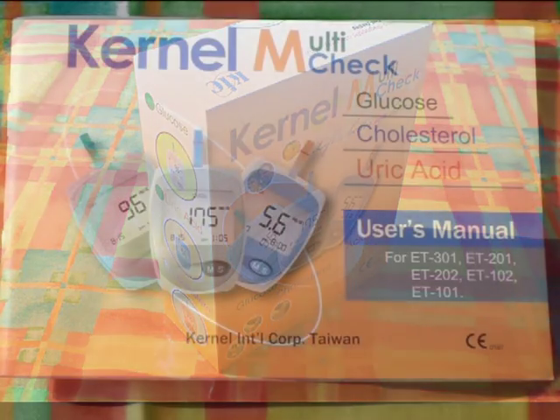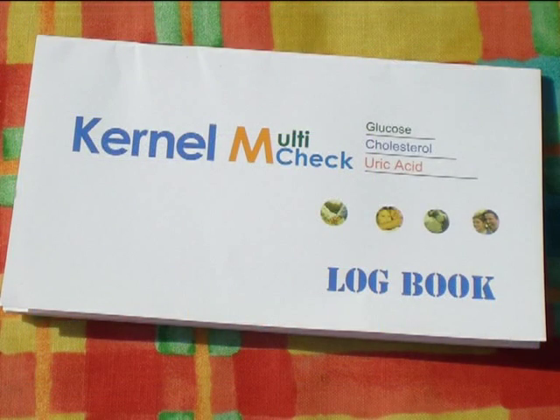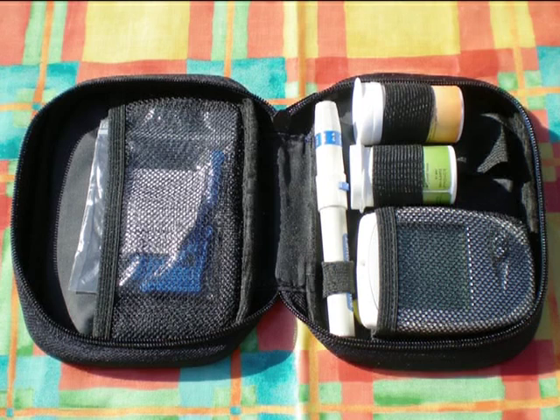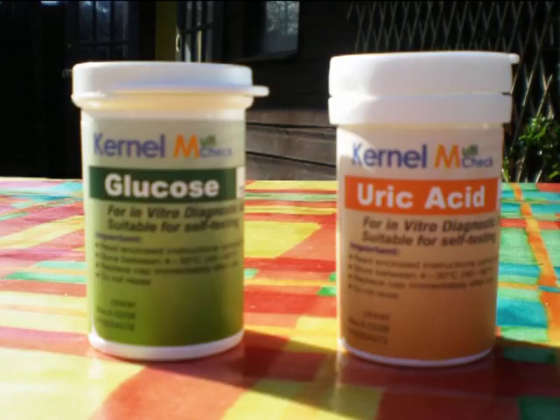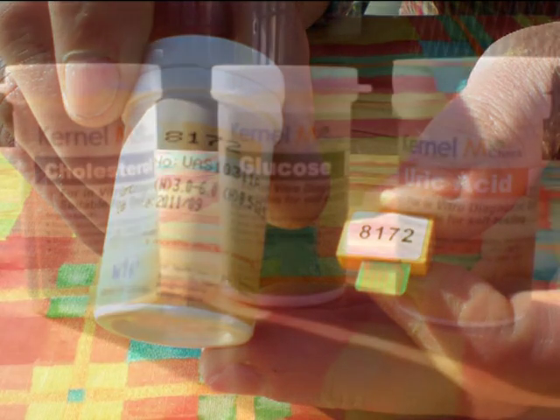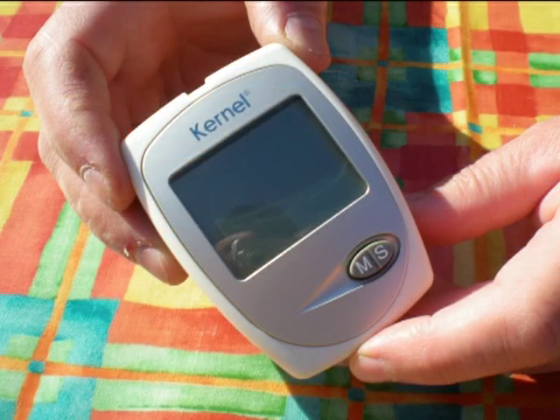Inside the box you will find a full instruction book, quick start guide, and a logbook in which you can record all your readings. There will also be the lancing device and lancelets, which is the tool you use to get your blood, the glucose and uric acid test strips in a tub along with the test chip, and if you've ordered the cholesterol testing strips you will also receive them. These are all colour coded on both the test strips and chip. You will also receive your meter and batteries.